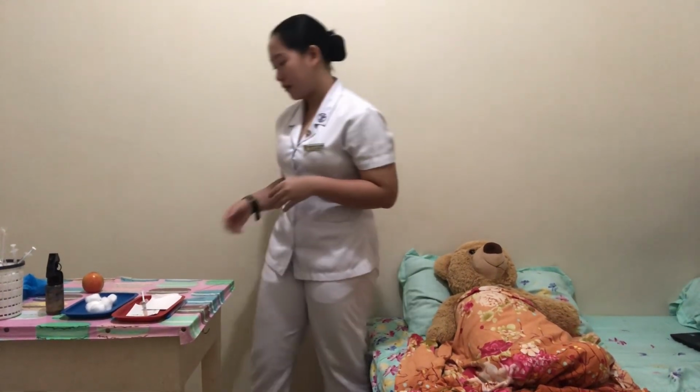The last procedure is the intramuscular injection. So it is the introduction of medication deep into the muscle tissue, wherein a large network of blood vessels can absorb it readily and quickly. So before anything, check the doctor's order for the patient's chart.